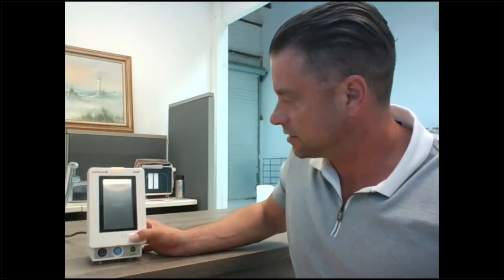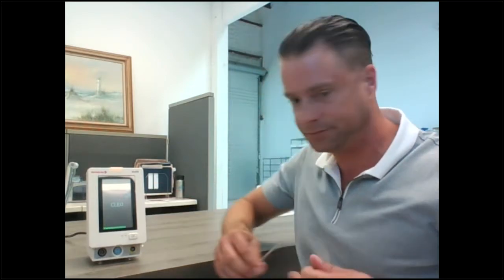To begin measuring CO2 or any of the parameters, turn the monitor on and once it loads up we can get started. I'll show you how to measure CO2.